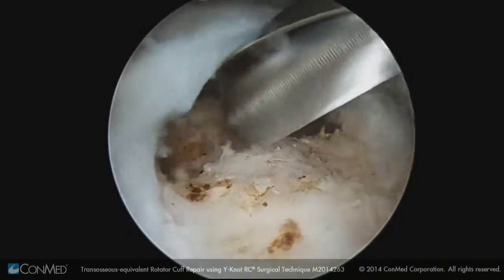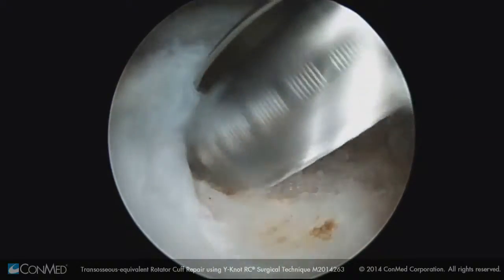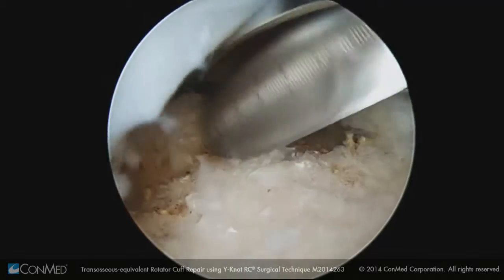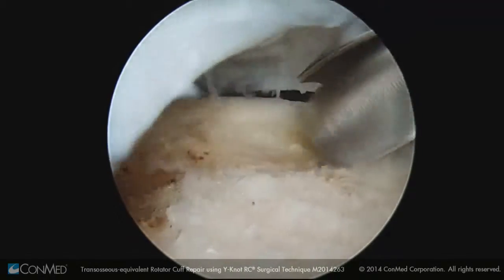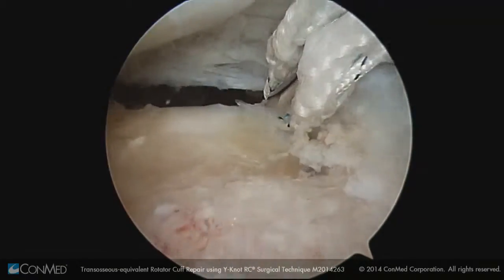Here we're beginning with the standard step of lightly abrading the greater tuberosity. It's very important to maintain cortical integrity so that the Y-knot RC can have adequate purchase beneath the cortical surface. So we're simply painting the surface to get a light blush from the cortex.